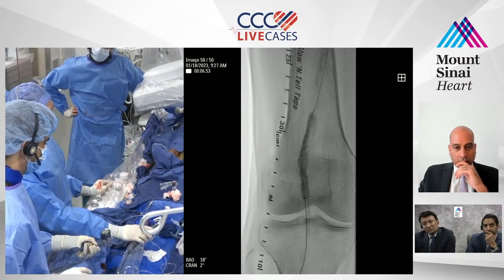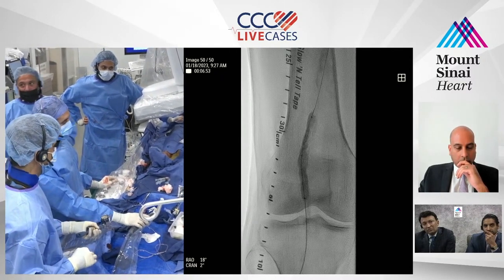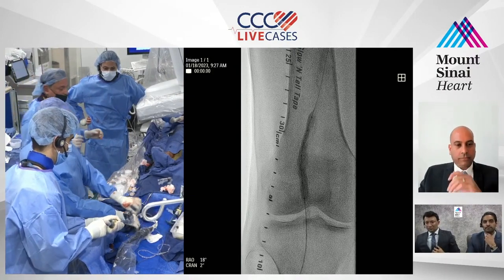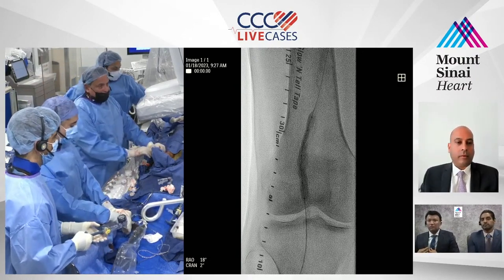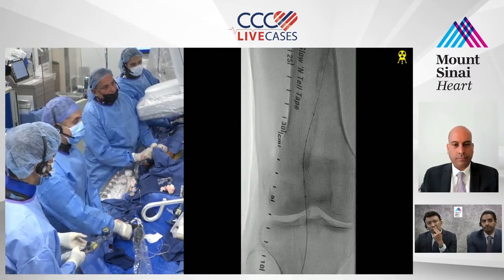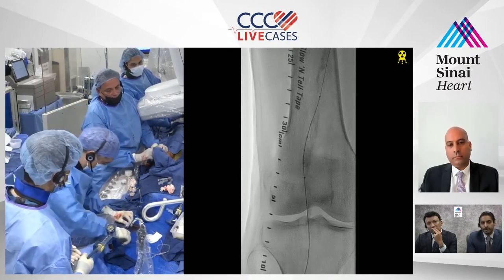The coronary guys, including myself and Vishal and Raman, we use it in calcium in the coronaries. To me, I've never been impressed with the results in calcium, but SS, the director of our lab in interventional cardiology, swears by it. Obviously, Rota is his number one there. But sometimes what happens is when you have a focal lesion, guys, pull the wire through, pull it hard. Hold on. Let me put on the mosquito. Wait.